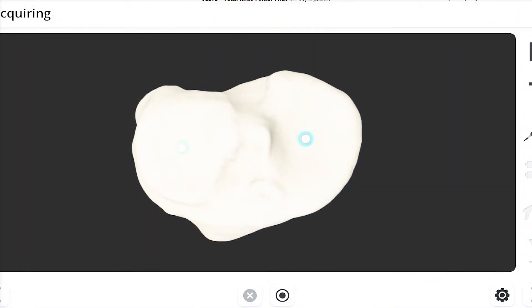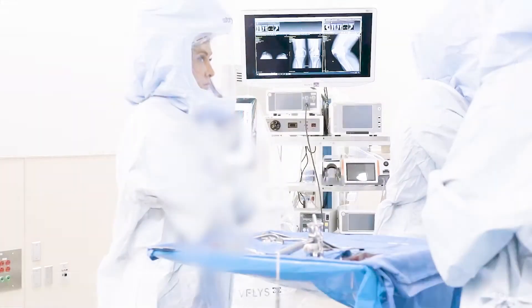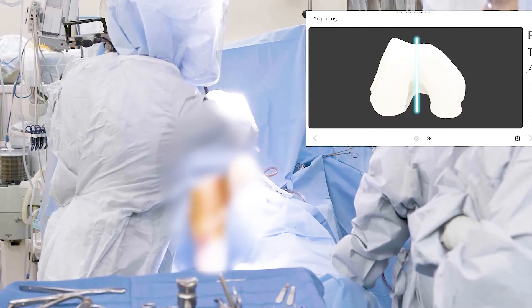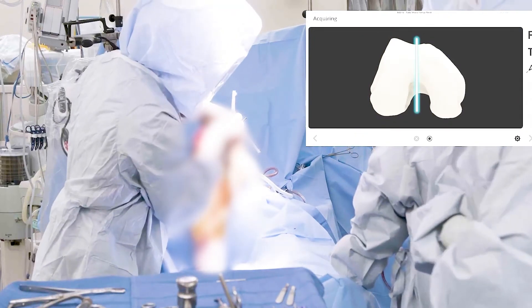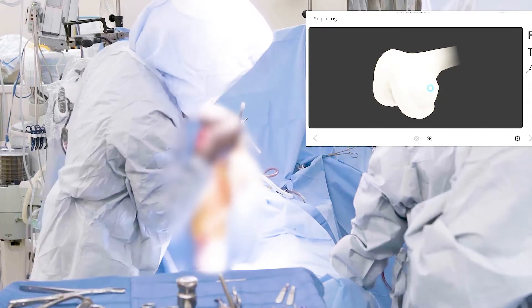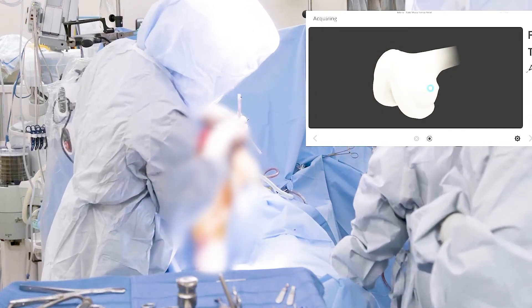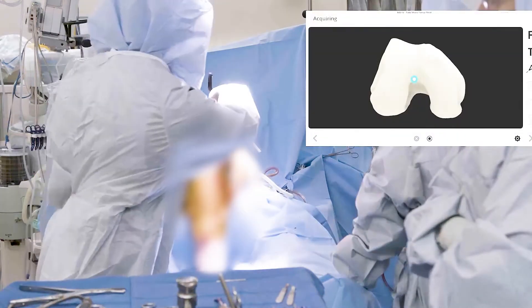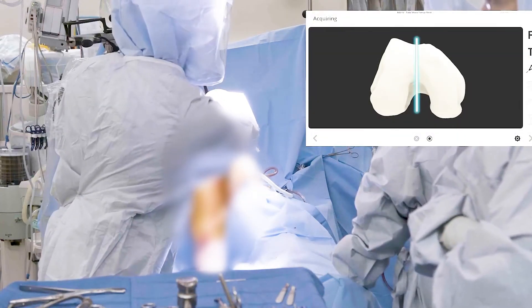This particular system does not require images prior to the surgery and only utilizes information obtained during the surgery itself. Once the patient's unique anatomy is accurately registered, your surgeon will go through a set of checks to ensure adequate registration. Following registration, your surgeon will take the knee through a range of motion to assess the knee dynamically, or while it's moving. The system will display all knee abnormalities throughout the full range of motion.